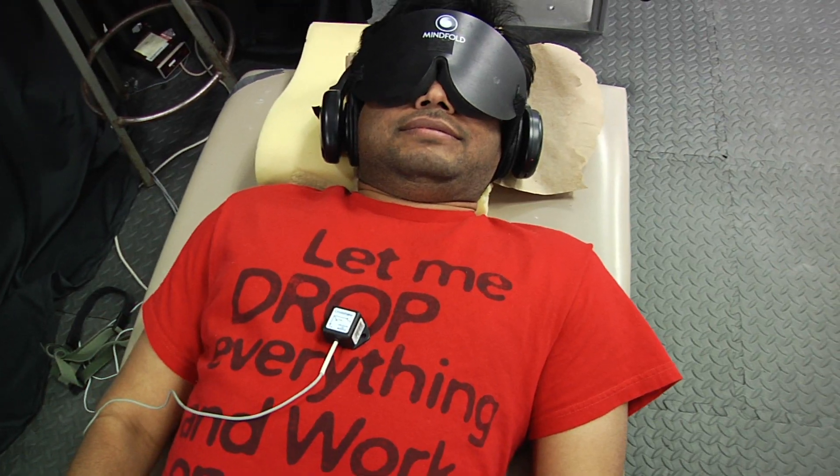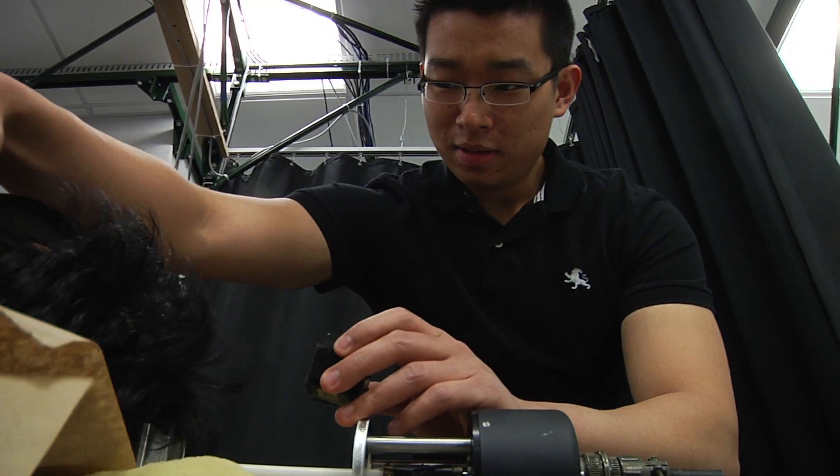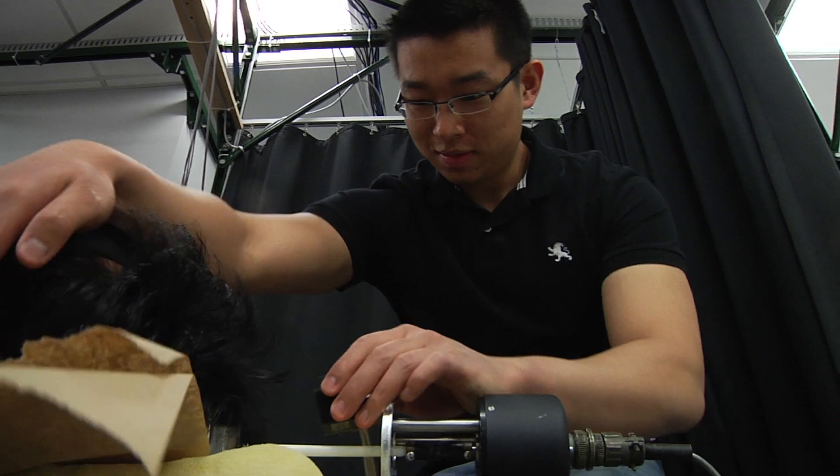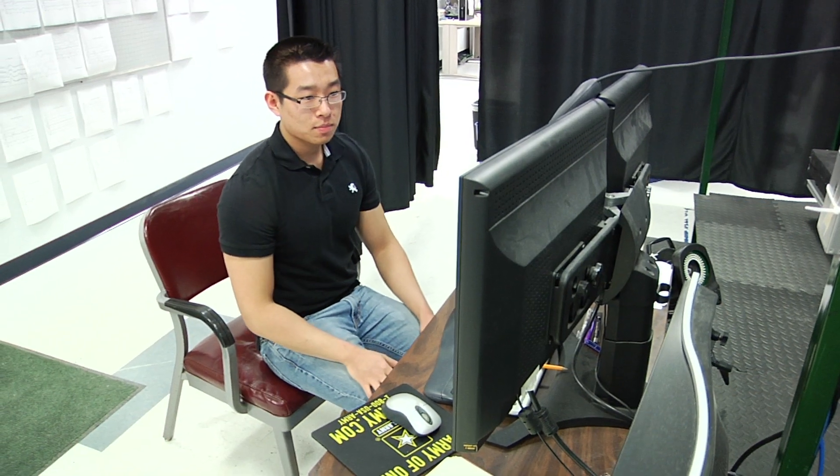We use two accelerometers to measure a person's pulse wave velocity. So we have one accelerometer right over the person's heart and the other one on the person's head. So using these two accelerometers we can measure the vibrations that propagate through a person's body caused by the heart, and then based on the time delay or the time it takes for that pulse to travel, we can calculate the pulse wave velocity.